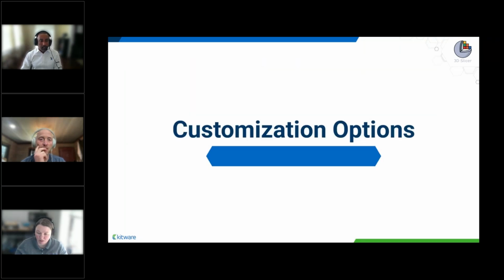All right. So we covered the primary use cases of 3D Slicer. Next, we'll walk through the different ways of customizing 3D Slicer, and then we'll have a live demo. To guide us through this, I'll hand it over to Sam Horvath. All right. Thank you, Antoinette.